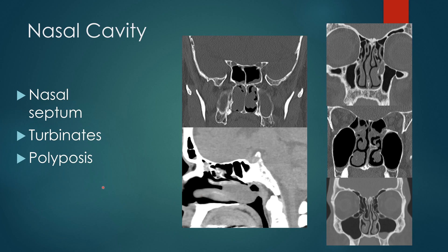For the nasal cavity, you want to evaluate the nasal septum — is it in the midline, is it bowed to the right, is there an associated nasal septal spur? You want to look at the nasal turbinates: superior, middle, and inferior. There is a variant called a concha bullosa, or an aerated middle turbinate, that can contribute to osteomeatal complex dysfunction. You can also get nasal polyposis — polypoid soft tissue density material within the nasal cavity. The sagittal view is helpful to confirm polyposis, as it separates the soft tissue from the adjacent turbinates and distinguishes it from mucosal thickening.